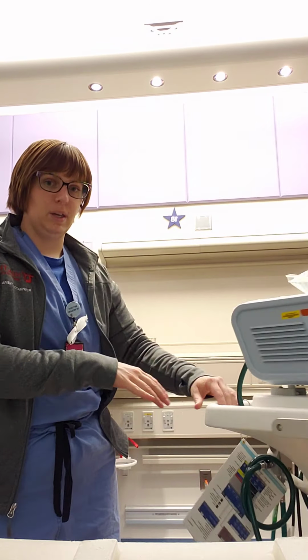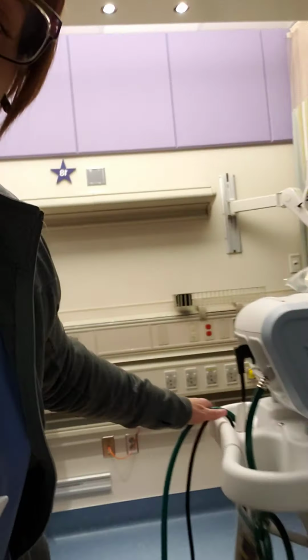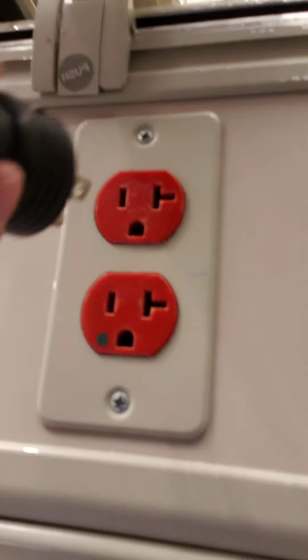I'll come and I will get my equipment. I will plug the oxygen into the oxygen port, you just push. And my electrical into the red circuit.